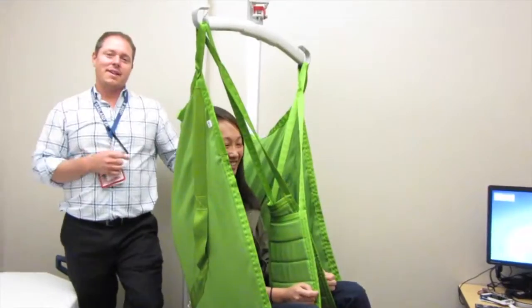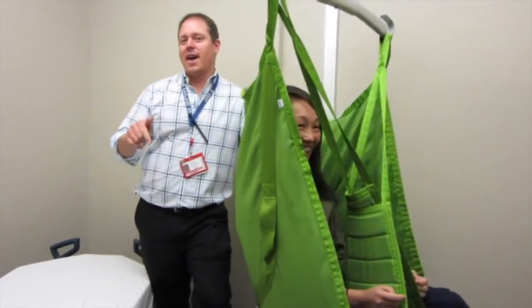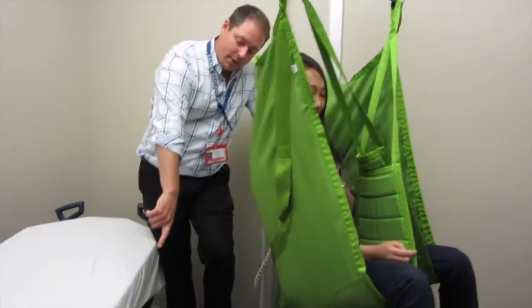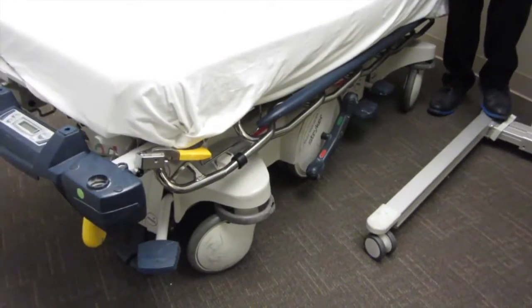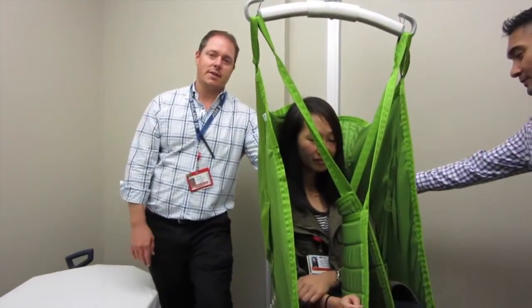So the last thing we're going to tell you about using the Golvo is that you have to actually approach the beds from either the head or foot of the bed. And we find that the foot is typically the most practical place to approach the bed. The reason is that our big wheels, I don't know if you can see down here, that are on both our Zoom stretchers as well as our non-Zoom stretchers, prevent the legs of the Golvo from actually making it underneath from the side. It's an unfortunate design flaw.